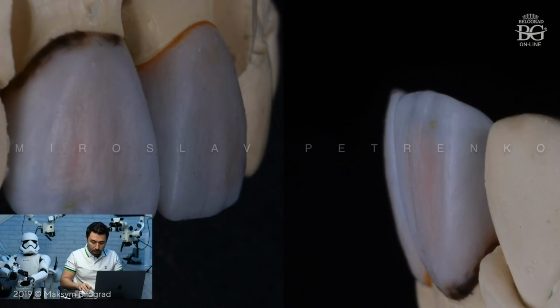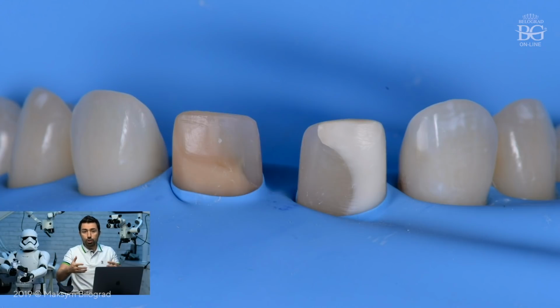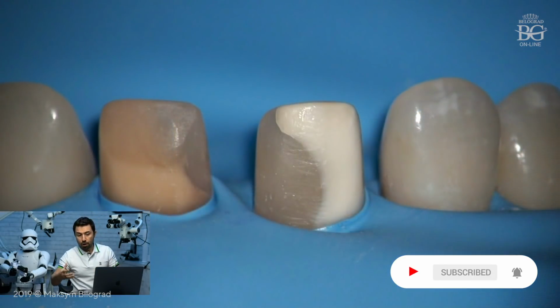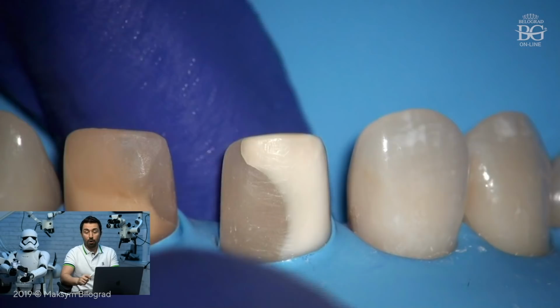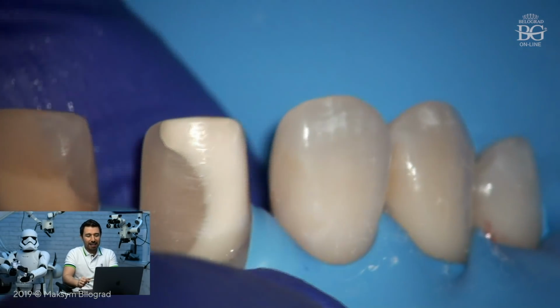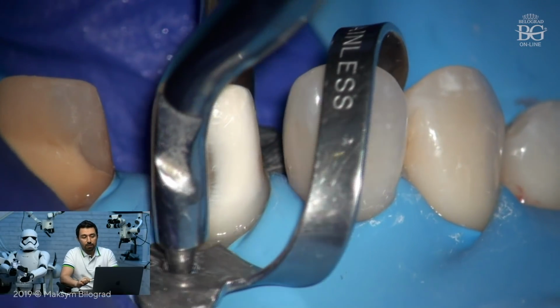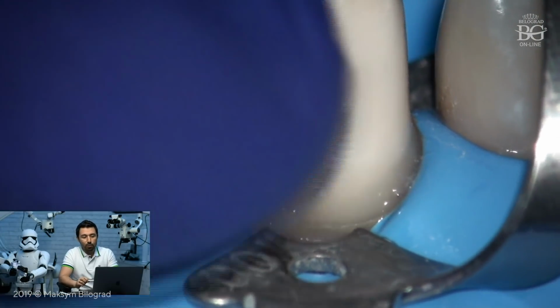The dental technician made ceramic Emax crowns, and once we got the ceramic crowns, the process of cementation was not super difficult because we had already developed and performed a nice emergent profile, the good architecture of soft tissues. So placement of the rubber dam now was an easy task, not the same as it was during the very first appointment when we were cutting gum and fighting with the gum and with everything.